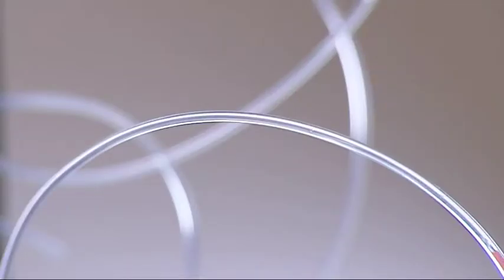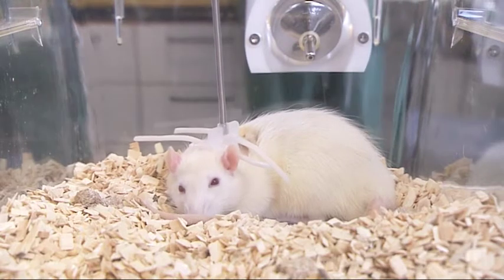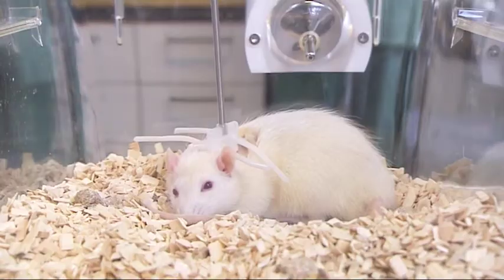Between samples, the system is cleaned with saline solution to minimize carryover. Cleaning of catheters also compensates for the animal's loss of blood to prevent dehydration. The AccuSampler compensates for the amount of blood lost with the same amount of saline solution.